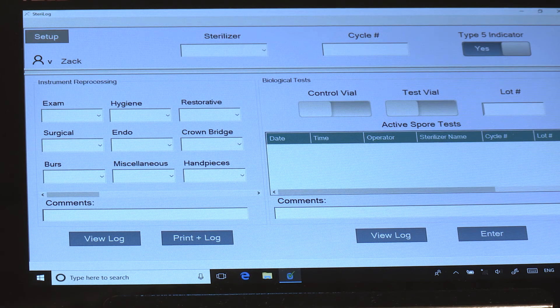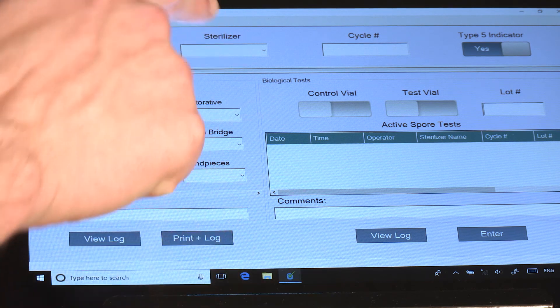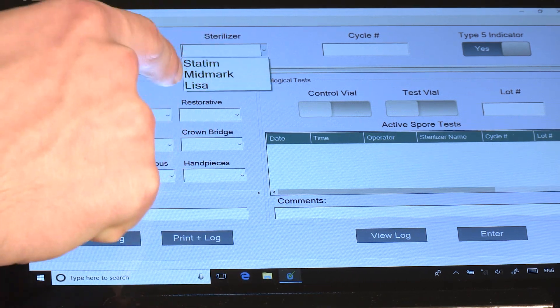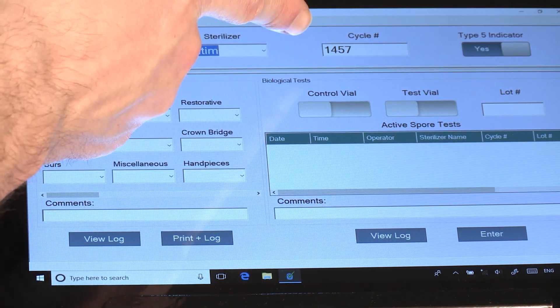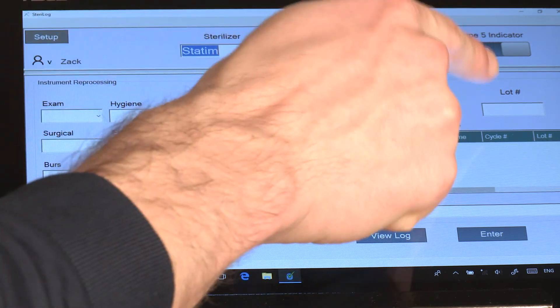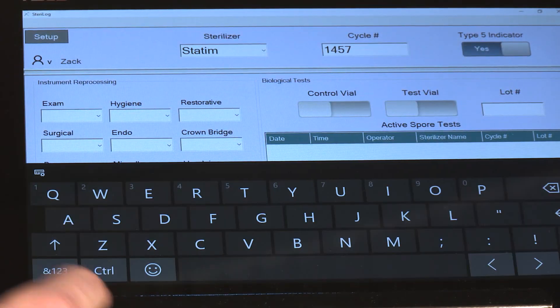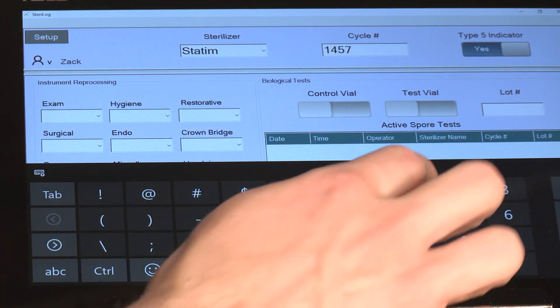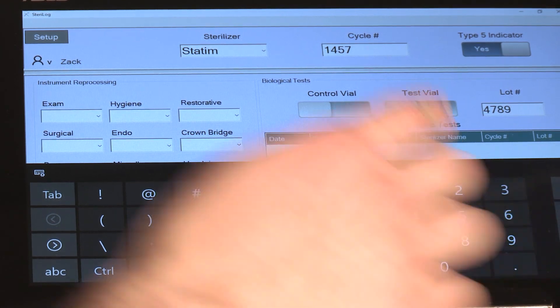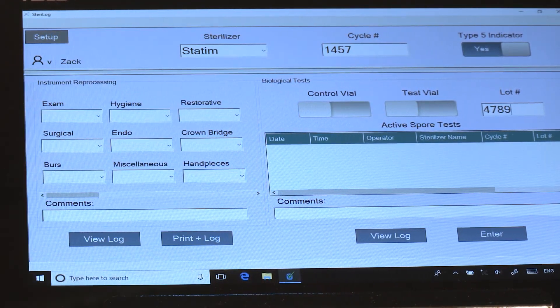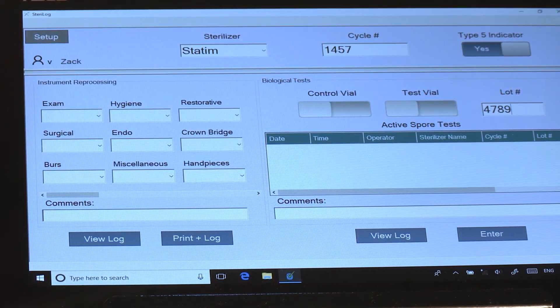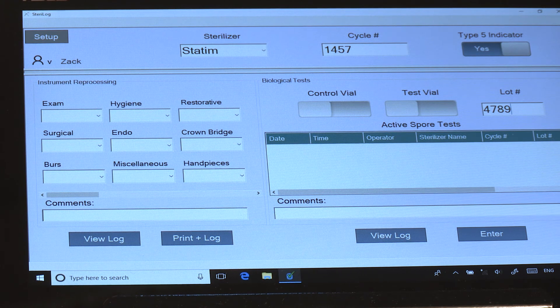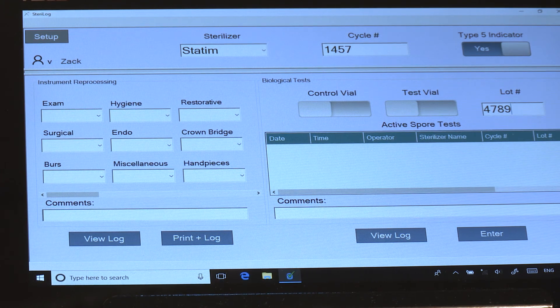To enter a biological indicator, simply select the sterilizer from the dropdown, let the cycle number be auto-populated, and for the first time key in the lot number.